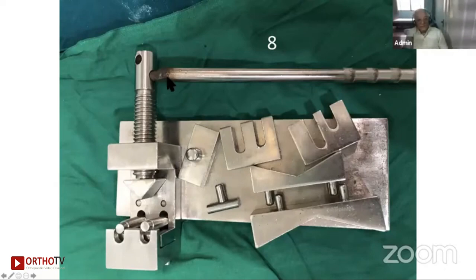The only thing is, as you can see here, this tip breaks down, so it has been re-welded. But this is not strong enough. You need something which can come out, and then it is much easier to turn it and bend the plate very well. So this is Jawar Jethwa's design plate bender, which is very, very good.